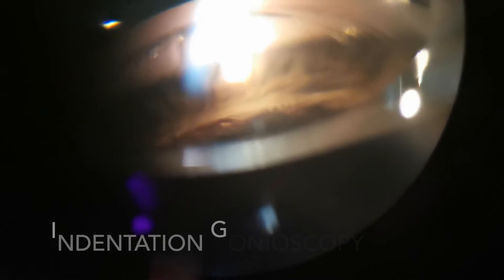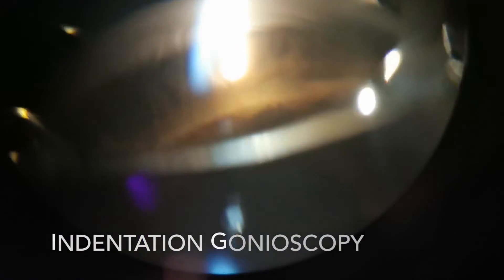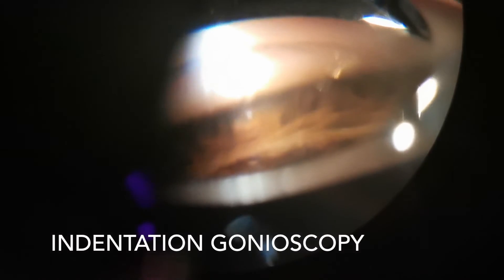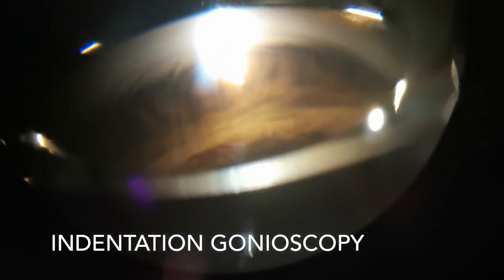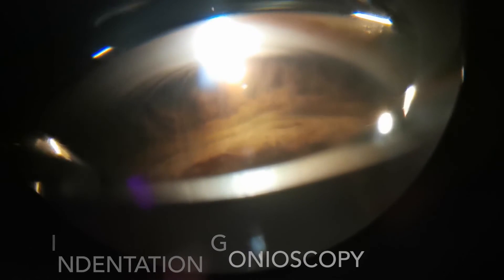Indentation gonioscopy is a strategy that helps determine whether angle closure is the result of the iris being in apposition or touching the angle, or is the result of the iris actually being stuck on the angle via peripheral anterior synechiae. It's a great tool for diagnosing plateau iris as well. As you can see here, it involves applying pressure with the lens to the central cornea, which drives the iris posteriorly. This technique is easy to perform with a 4-mirror lens but isn't feasible with a 3-mirror lens. The area of the 4-mirror lens that contacts the cornea is much smaller than the total surface area of the cornea, whereas the 3-mirror lens has a larger area. Additionally, the 4-mirror lens area is relatively flat, so when you push against the cornea, the cornea indents more easily and the iris moves more readily. The 3-mirror lens, in contrast, vaults over the cornea and touches the eye on the sclera.